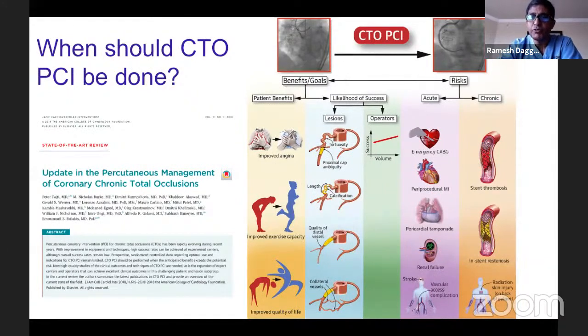Very rarely, stroke can also be seen. And ultimately chronic stent thrombosis, in-stent restenosis, and radiation skin injury from prolonged dose. But mostly now we are paying attention to it, and newer systems can go to lower frame rates. Even with my diagnostics, I keep trying to tell them to go to 7.5 and 15 frames per second. And obviously time is the most important factor in that.